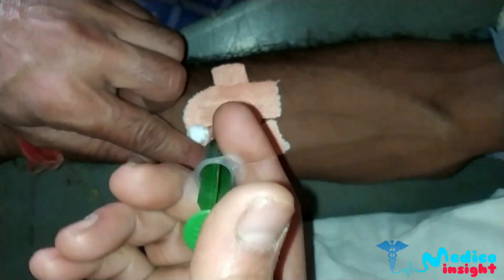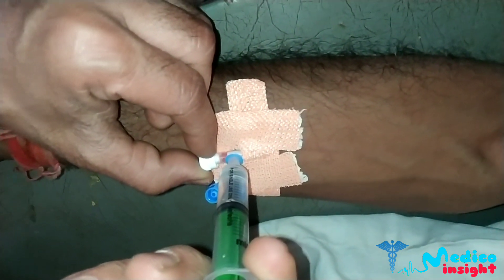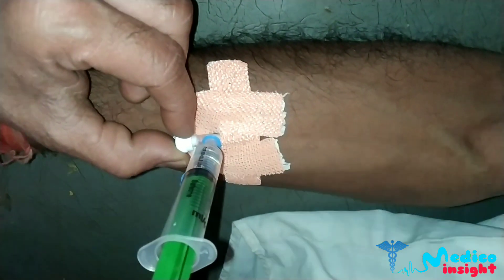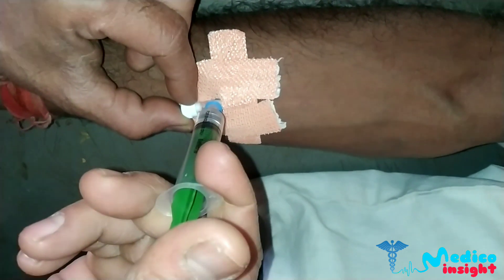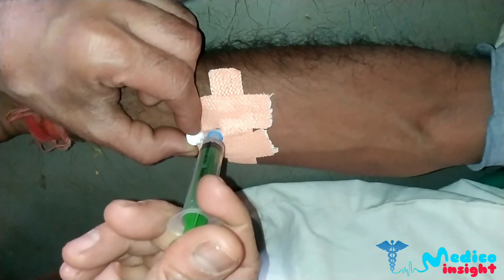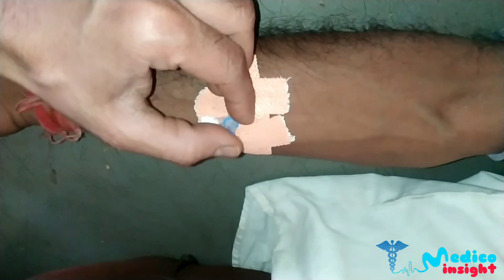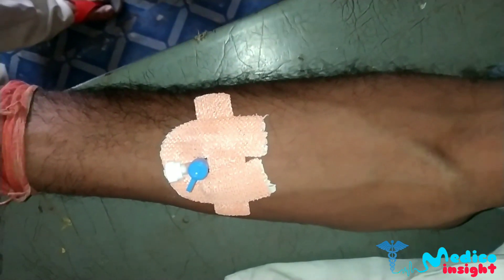Flush the saline with the syringe through the cannula to check patency. As we can see, there is no resistance, swelling, or pain. If any of these occur, we should remove the cannula or start the procedure again. This is all about intravenous cannulation.